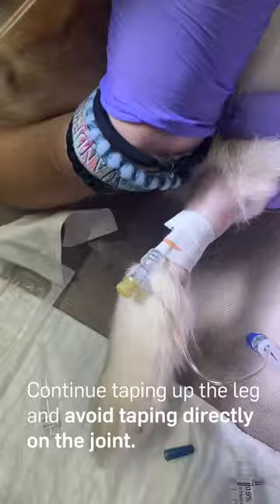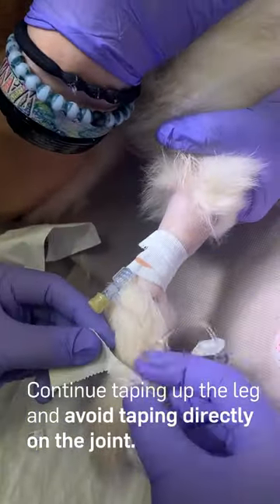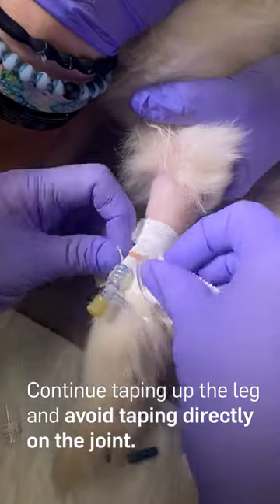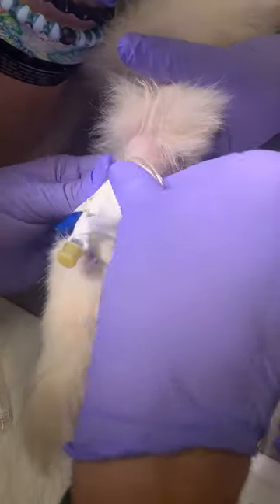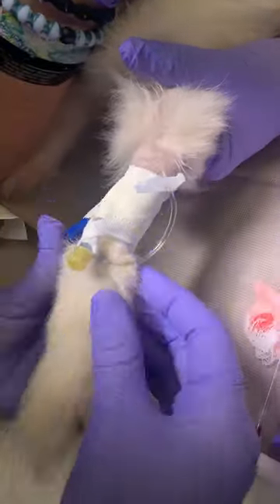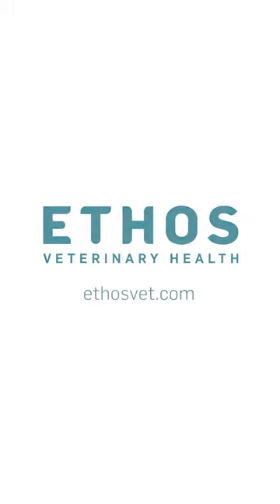Continue taping up the leg to cover more surface area. Avoid taping directly on the joint to help prevent paw swelling and catheter movement. The IVC should be broken down and reevaluated at least every 24 hours and monitored hourly for any signs of pain, infection, or swelling.